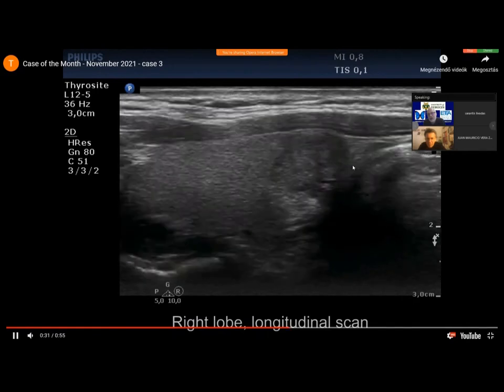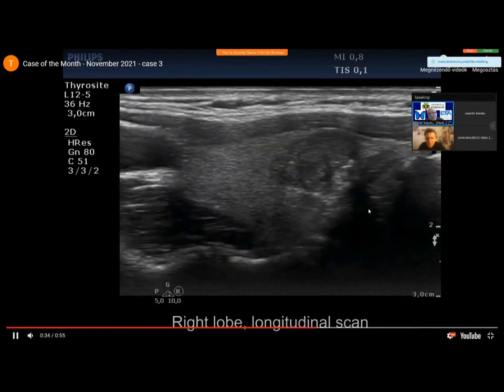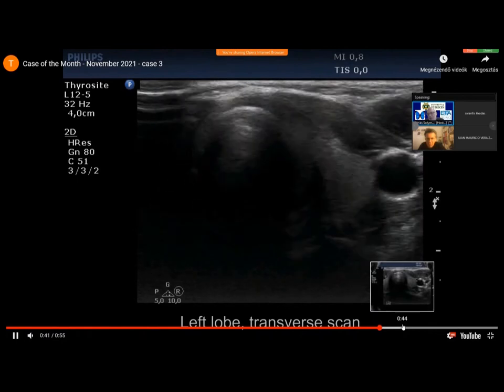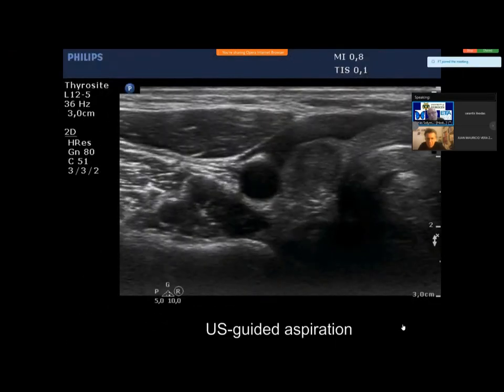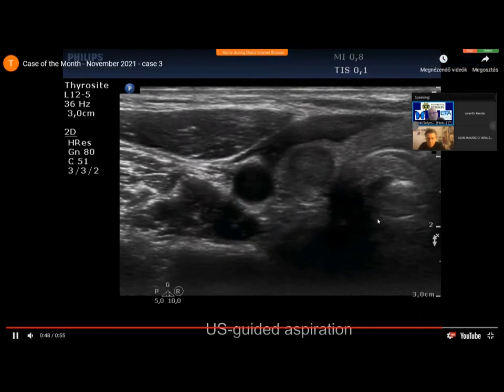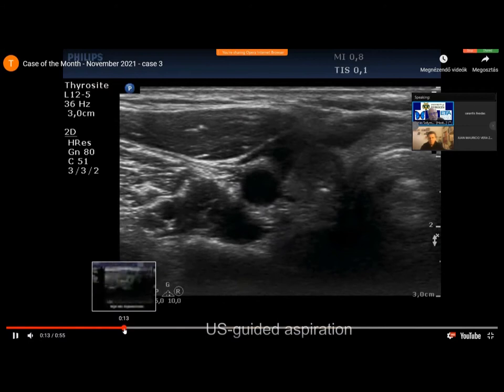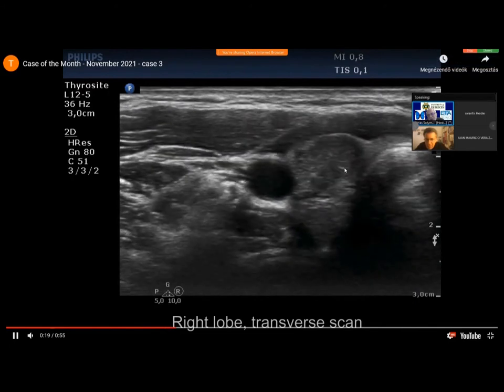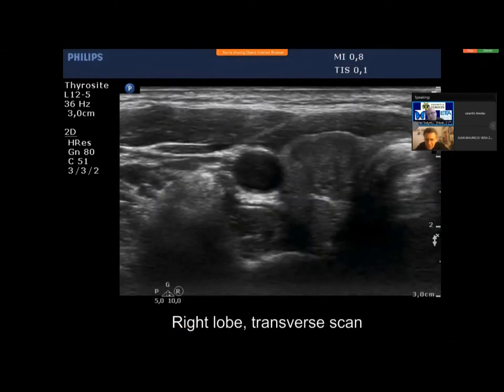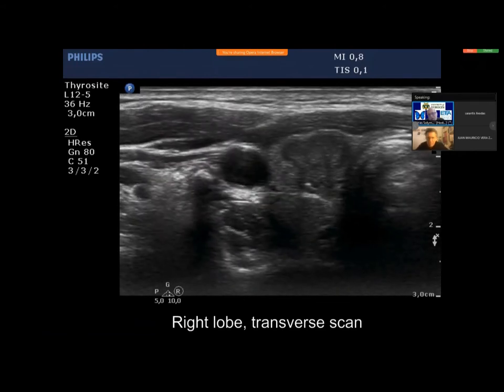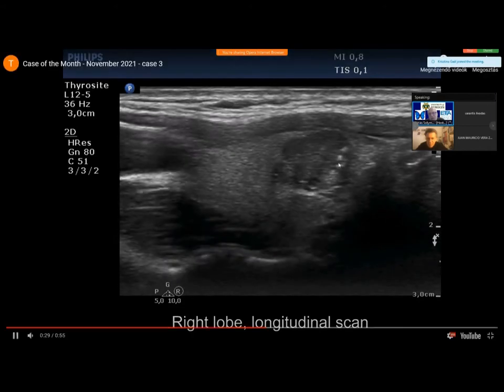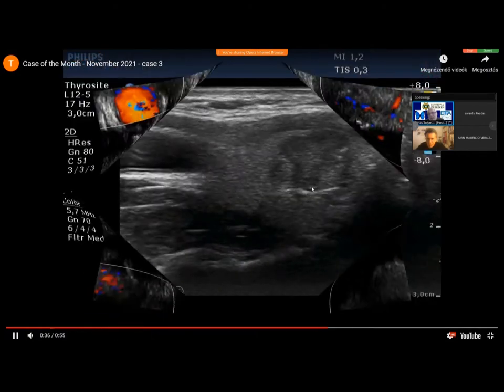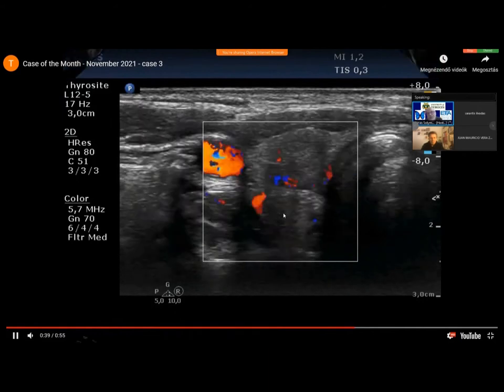I think that the issue is these large granular dots or granules. In my opinion, these correspond — most of them — to microcalcifications. Some of them are located dorsal to tiny cystic areas. But if you make a detailed analysis, most of them lack this ventral cystic area and there are not many lines. There are some echogenic lines here, for example. But these dominant, quite large granules, I think these correspond to microcalcifications.